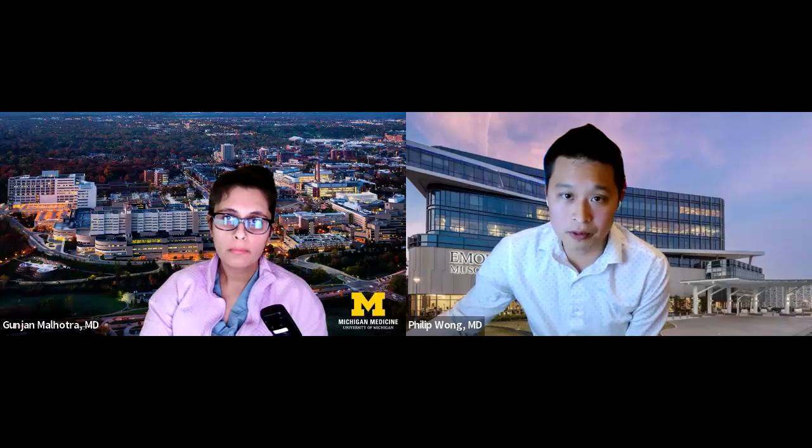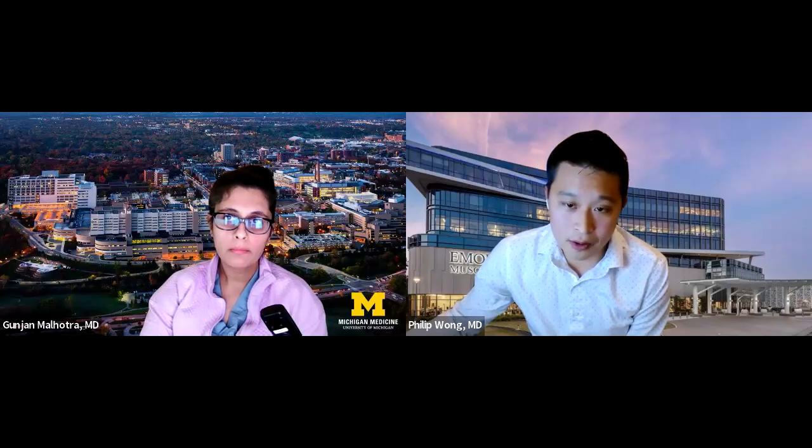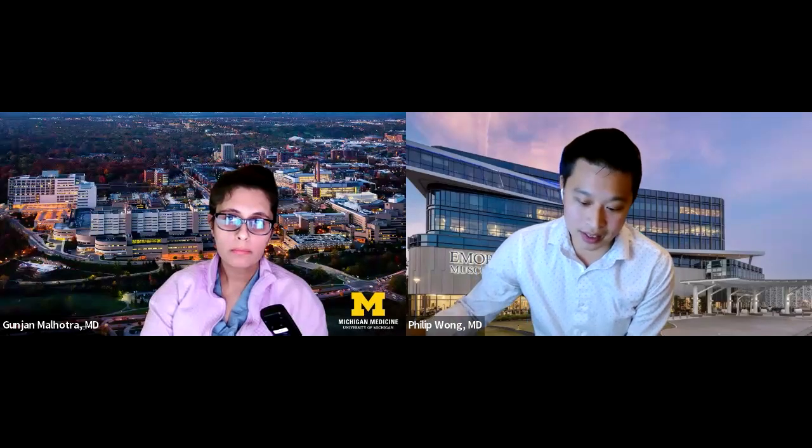Oh, post-operative repairs and reconstructions. I think if it's a superficial nerve, ultrasound is going to be your best bet in terms of finding if the nerve fascicles or nerves are injured. And if you have a preoperative MRI or something to compare to, that would be the best way to go about comparing.